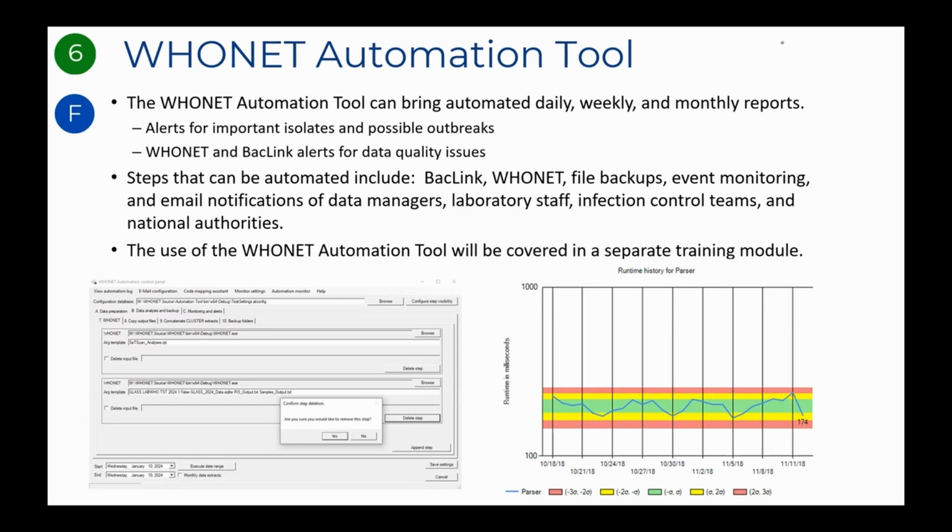Two screens of the WHONET automation tool are shown here. The user interface is seen to the bottom left, whereas an example of a monitoring graph is shown to the right.